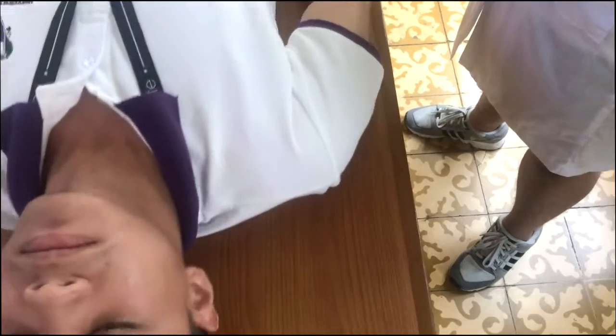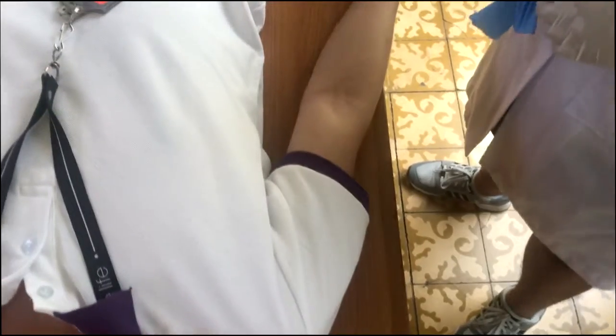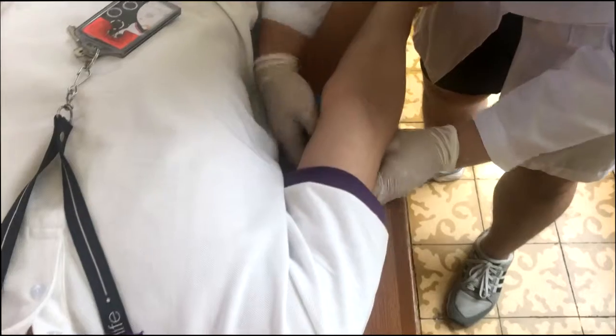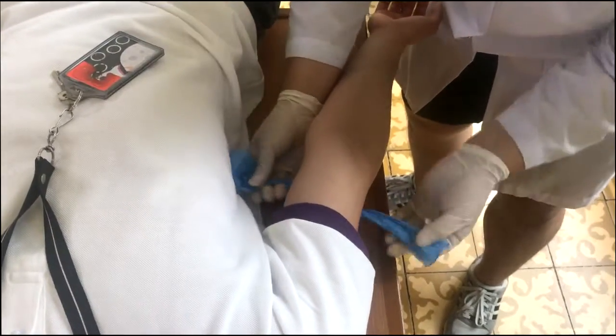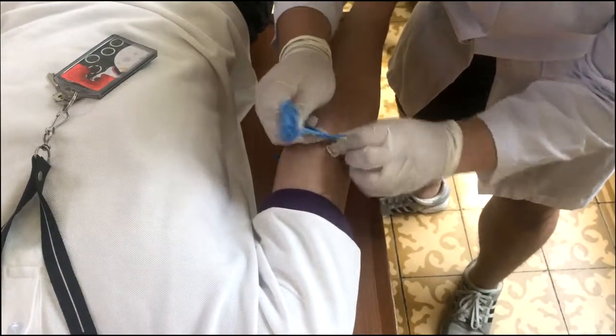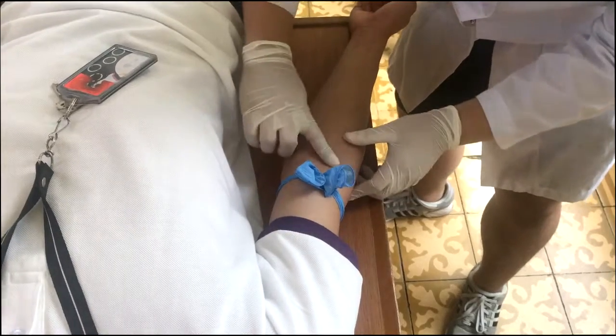If a patient is aware that he or she gets lightheaded or has previously fainted while having blood collected, the patient may alert the phlebotomist. The phlebotomist must then take appropriate measures to safeguard the patient — for example, instructing the patient to lie down instead of sitting upright during the procedure.